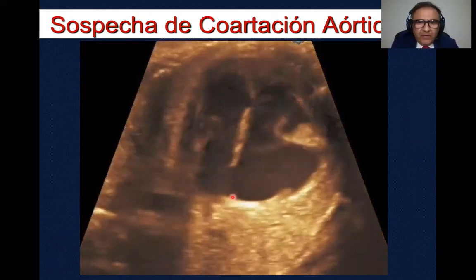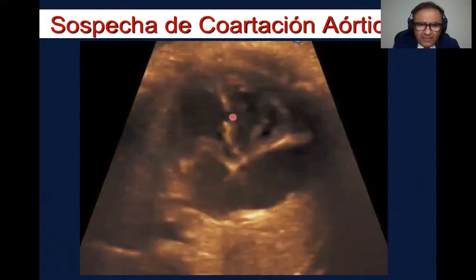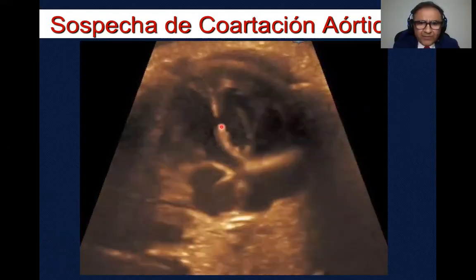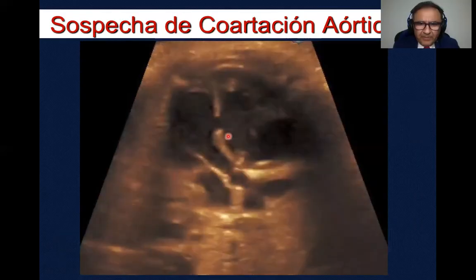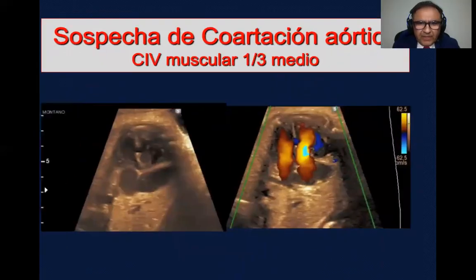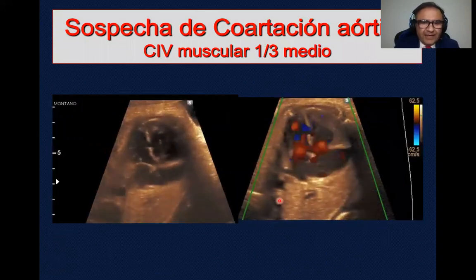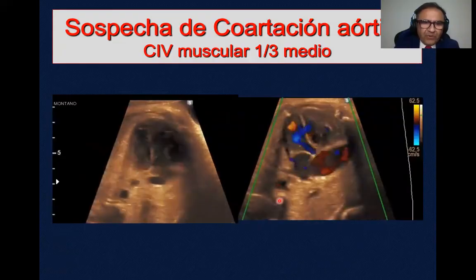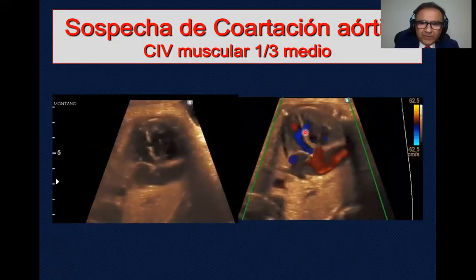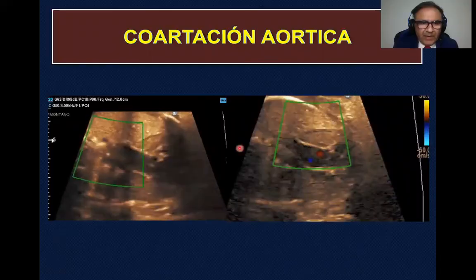Another case, this is a patient who, on the four-chamber view, had a large mid-third muscular VSD. You can see it here even without color Doppler. With this patient, you need to be very careful because she does not show a symmetry of the cardiac chambers or right-sided dominance, or she shows right-sided dominance, but only very mildly. Please note there is bidirectional flow on color Doppler.